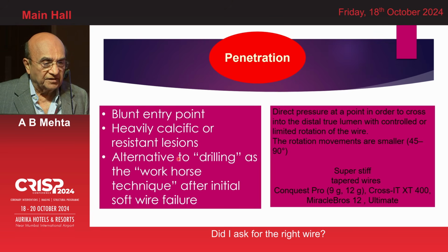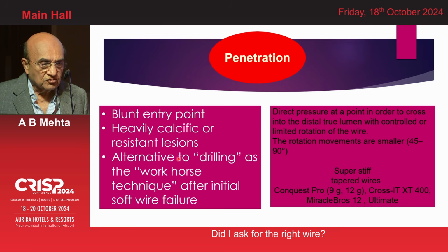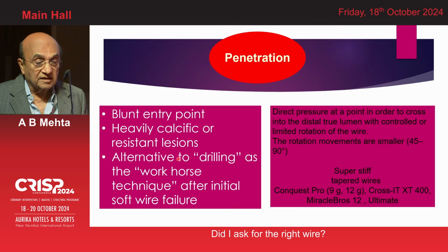All right, penetration is a blunt entry point. Now you can't do penetration alone. Simultaneously you keep on rotating, and that is called drilling. So penetration and drilling are combined together, and when there is a hard cap, it will not be very useful. You will come to know by your tactile sensation when you start with a simple wire like Fielder XTA that it's not going to be successful, and you might have to go to the stronger wire.